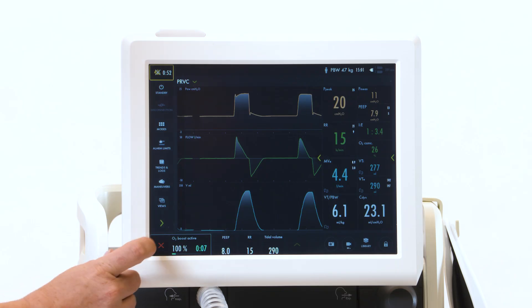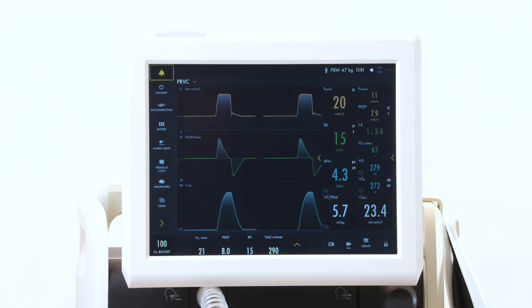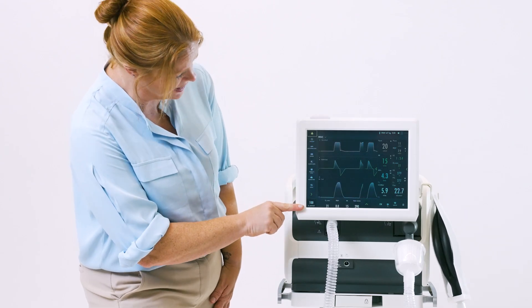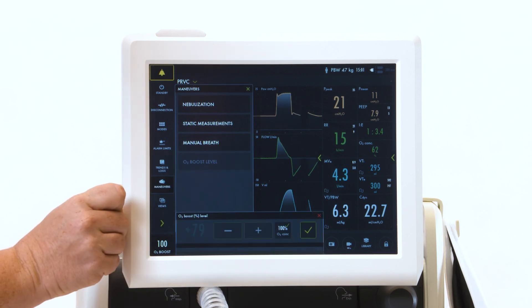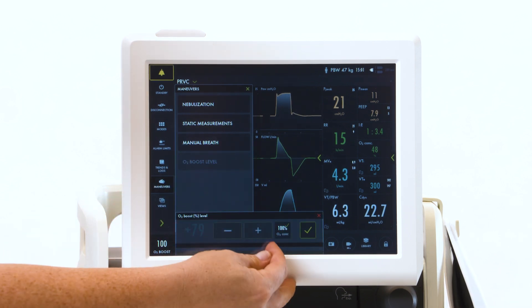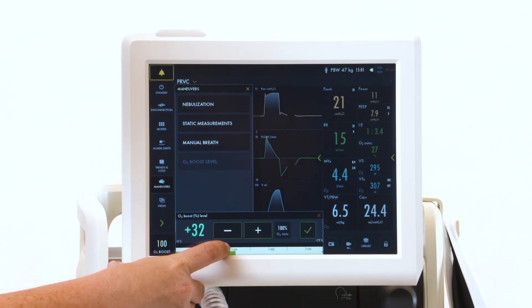If you would like to cancel, hit your X and it will cancel both at the same time. If you'd like to adjust that, go to your maneuvers and select O2 boost level. Currently, you can see it is locked in to 100%. You can unlock it and adjust this to whatever you would like.